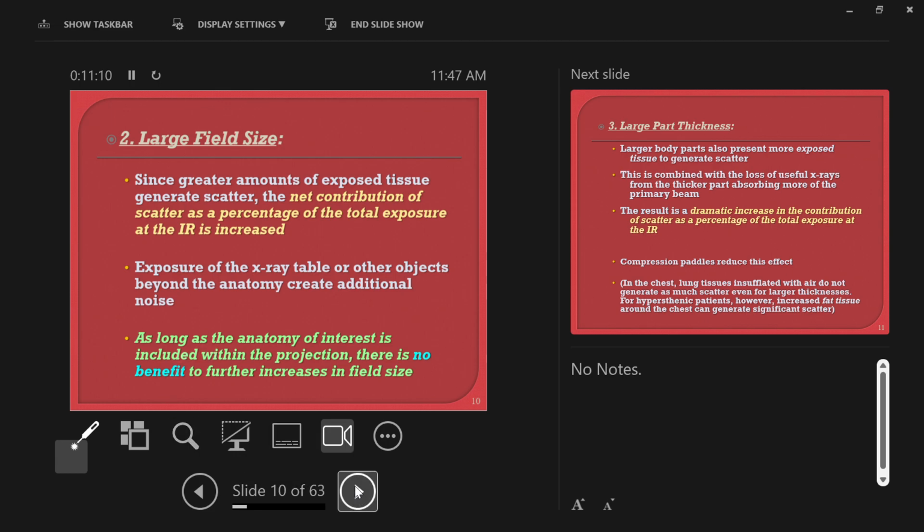Yeah, and that's why it's so important to have your collimator light working. One thing I'll do when I go in to inspect offices to make sure they can train students is, well, this one doesn't have it. I'll press the button on the collimator and make sure it turns on. Because if your collimator light doesn't turn on, how in the world are you going to line up the body part to the cassette and anything like that?